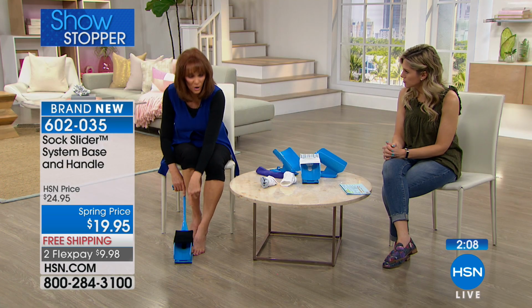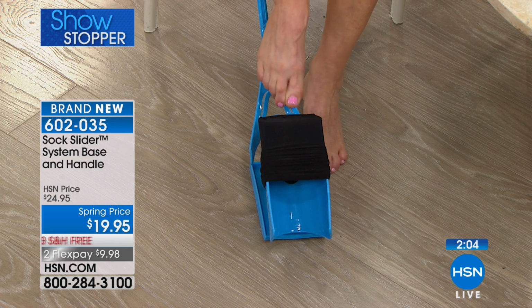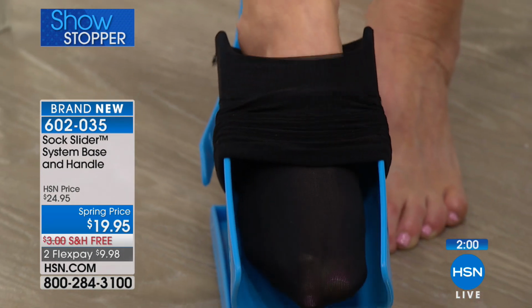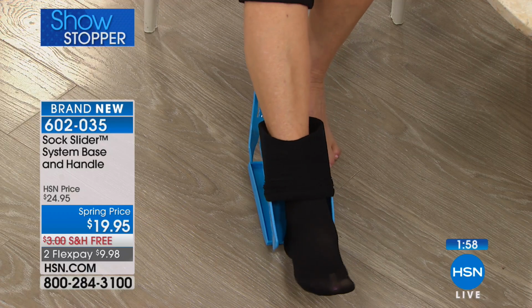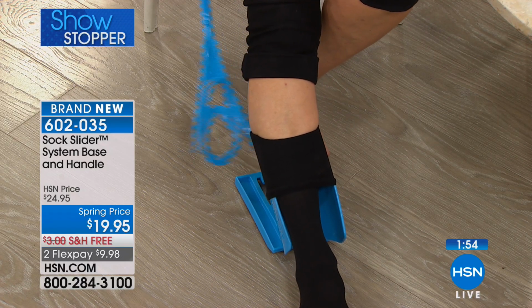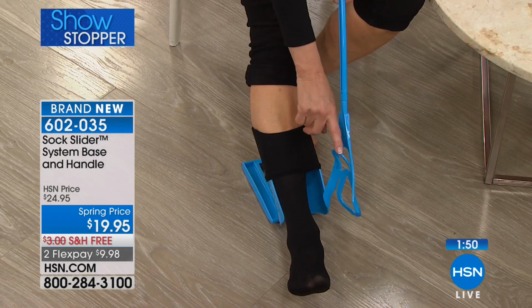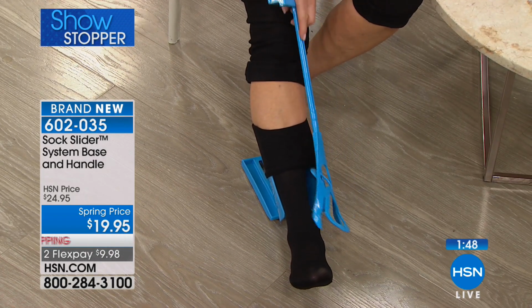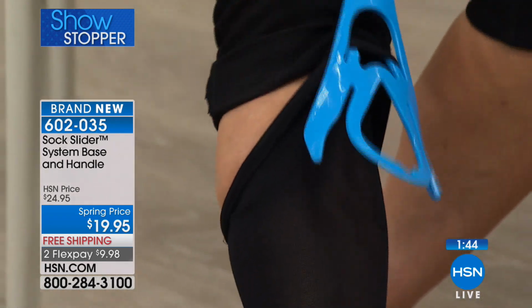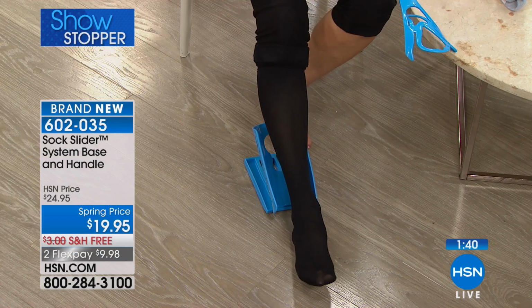Now, I have this sock on here, and this is an over-the-counter compression sock. I want you to see, it's going to be a little higher, and I've mounted it on there. Now watch how I go into it. If you have an over-the-counter compression sock, yes, it will work. Here's what happens with compression socks. You go through, and this is where you use your handy tool. This is a great tool. It's multitask. I simply go on up there, and then I can lift that sock up to me. You see that? I'm lifting it up to me, and now I can finish the application.